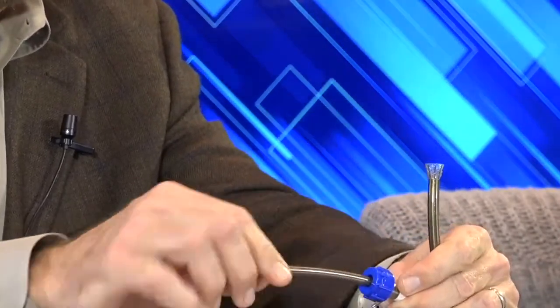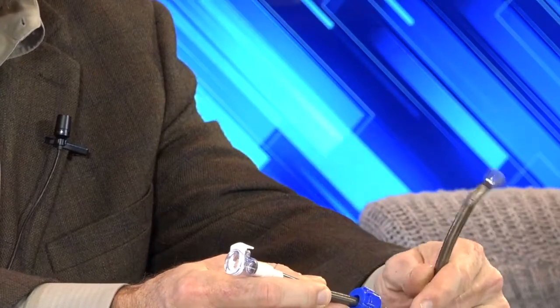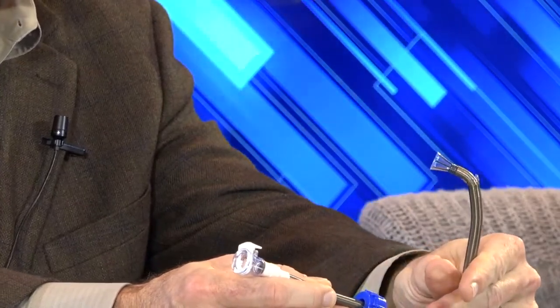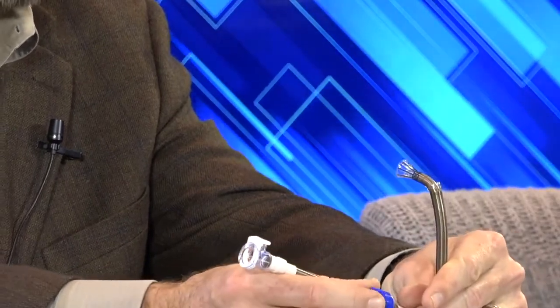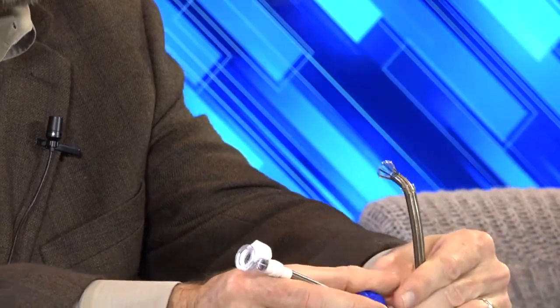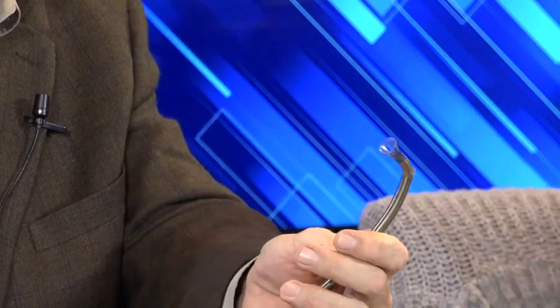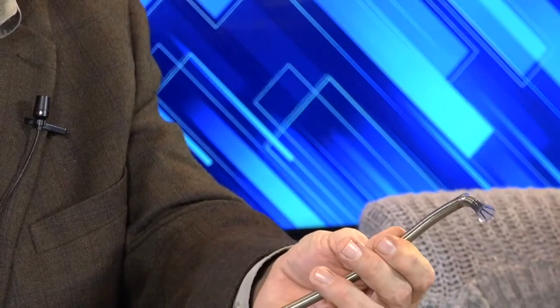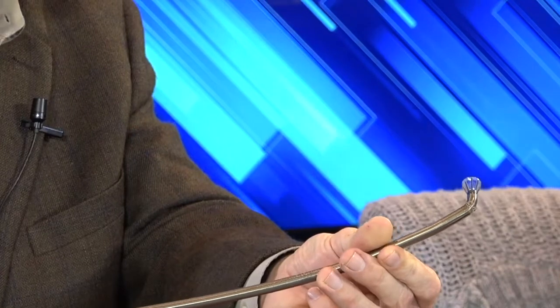If I'm coming from the neck and I need to have, let's call it about a 75-degree, 80-degree bend, we can stop it right there and lock that right into place. And now we can treat, as an example, and we're going to talk about tricuspid on this one, we can get the entire annulus of the tricuspid valve by simply rotating your cannula from one single approach and be able to get all the way around.